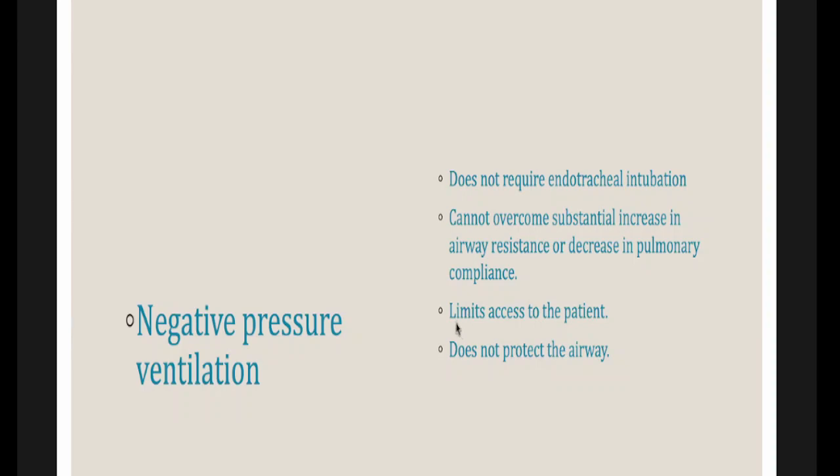The other problem is the patient is completely encased within the artificial lung, so you don't have access to the patient, not even IV access. And if the patient is at risk of aspiration, they can easily aspirate because the airway is not secure.